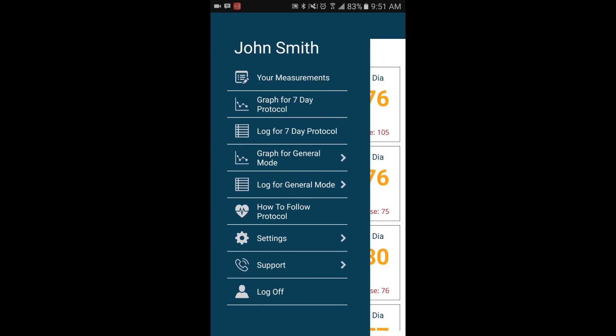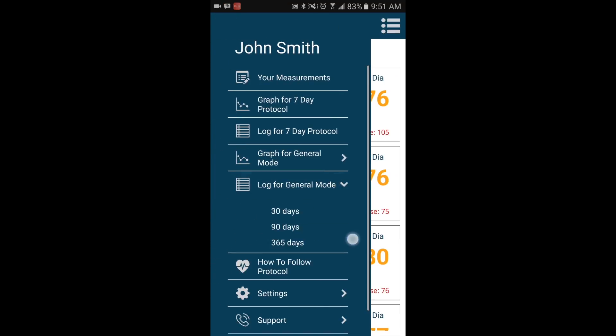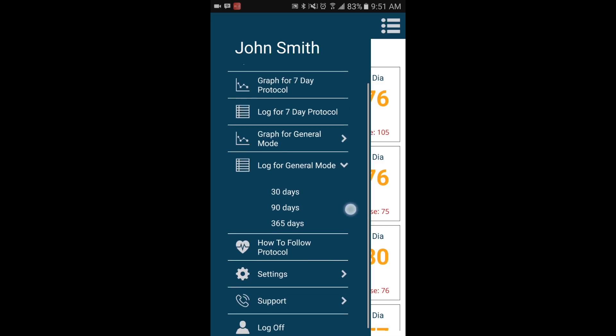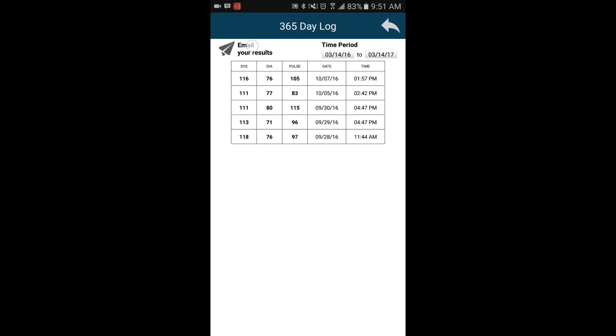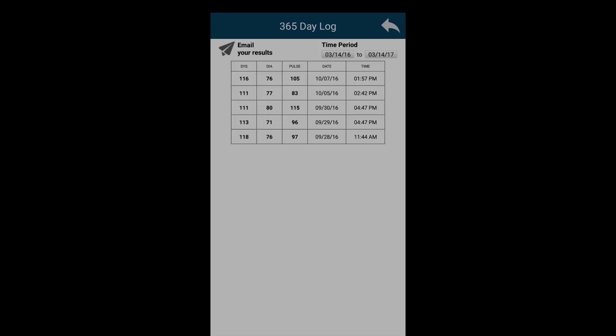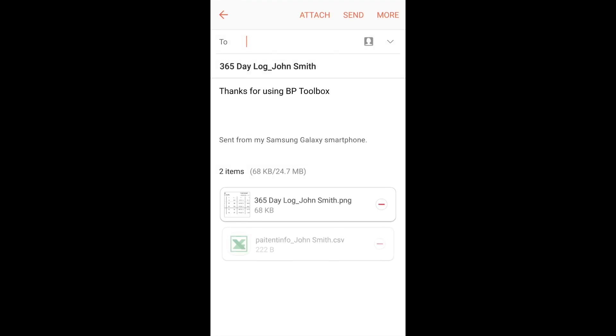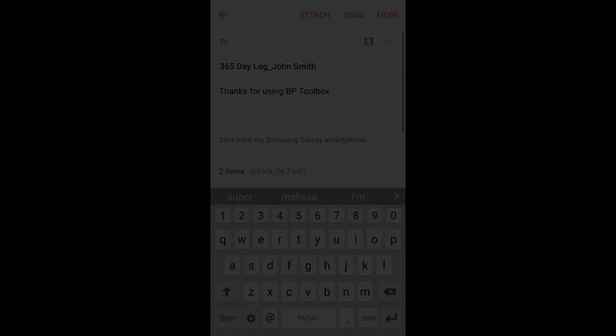Not only does your app track your blood pressure numbers, but it also allows you to see them laid out neatly in a graph or chart. With the touch of a button, you can email your numbers to whomever you need, whether it's your doctor or even a family member.